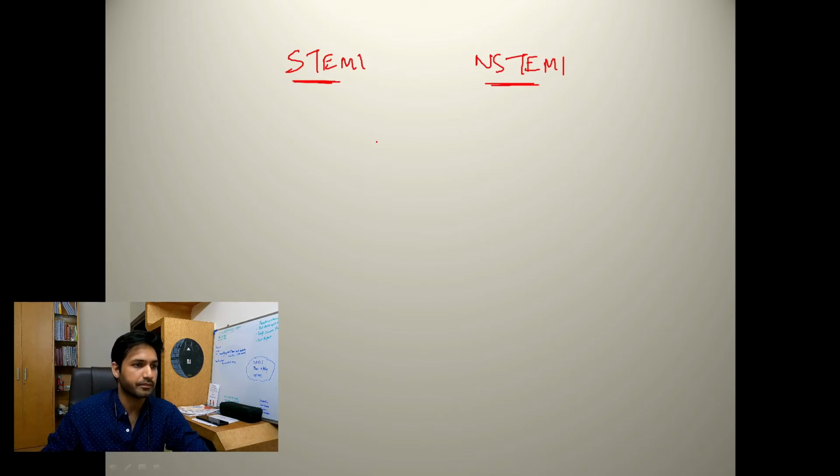Okay, now before finishing up, I just want to quickly touch on the topic of MI, because no ECG discussion is complete without talking about MI. So we basically have two types of presentations. We have STEMI and NSTEMI. Now, just by the names, you know that this is ST elevation and this is non-ST elevation MI.